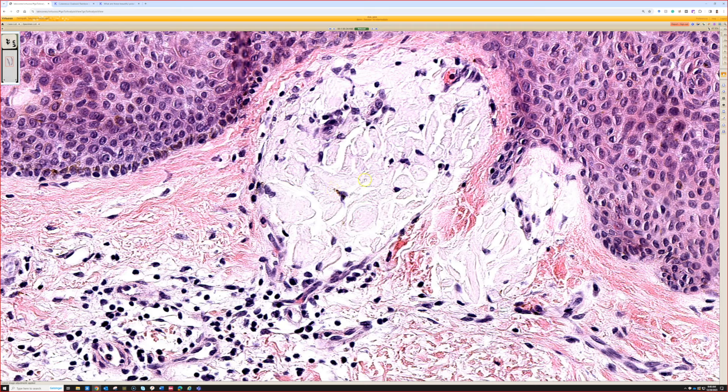This is keratin-derived amyloid. It has all the features we discussed in other keratin-derived amyloid situations, like macular amyloid of the upper back and amyloidosis of the lower leg. The melanin pigment present in the cracks is such a useful clue. The amyloid is right adjacent to the tumor — here, next to the seborrheic keratosis. In a basal cell it'll be directly adjacent to the basal cell carcinoma. Near this papillary dermal vessel, it's not in the vessel wall — it's in the dermis; the vessel is just trapped in the middle of it.